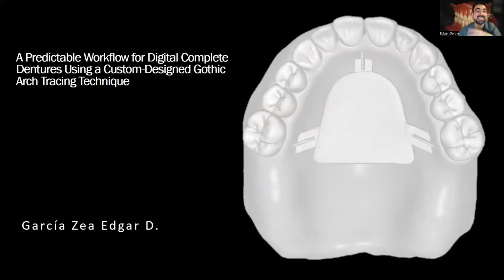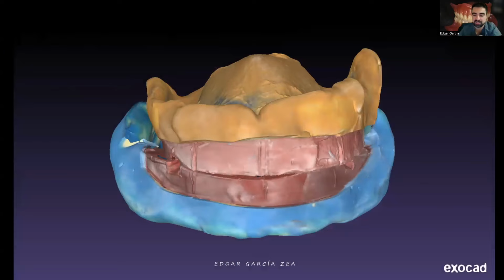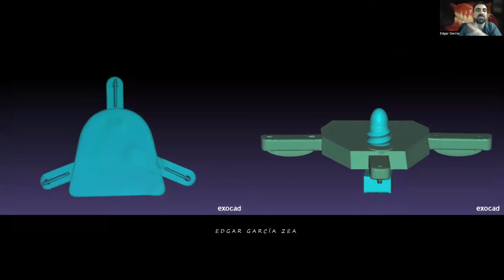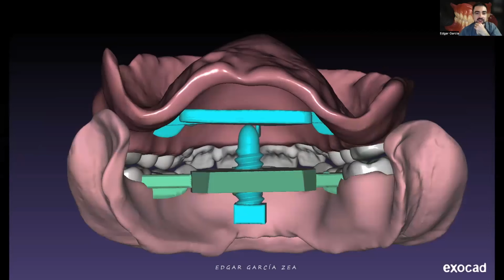So in the second appointment, I think the third appointment, I was not going to do prototypes, but I designed dentures with the intention of helping me do a second, more exact occlusal registration. So I adapted these STL files to the prototypes, and I printed them. Also, I eliminated the anatomy of the posterior teeth. I only maintained the anatomy of the six anterior teeth.